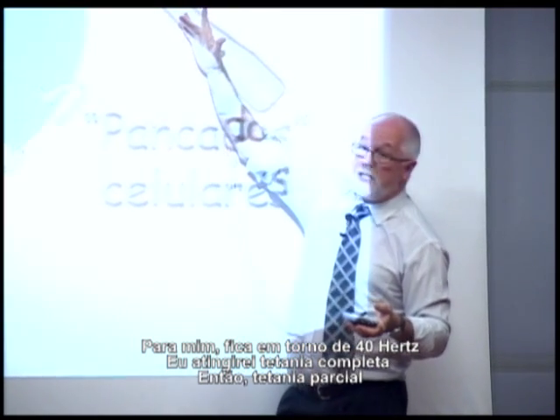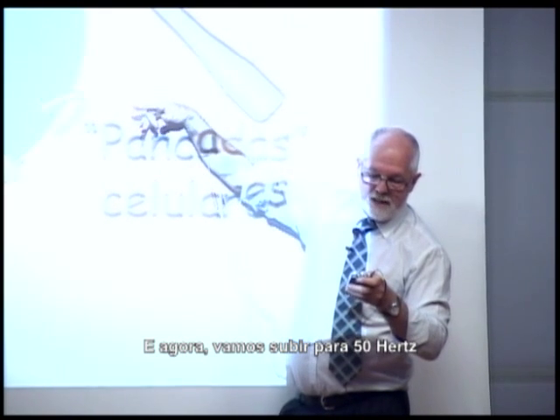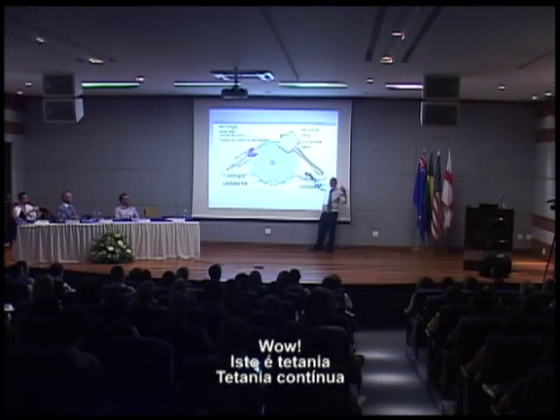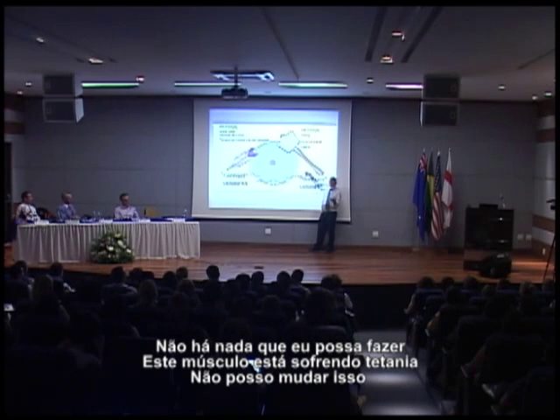So partial tetany, and now let's go 50 hertz. That's tetany, continuous tetany, all the time. That's not nice. All right? Okay. There's nothing I can do. That muscle is in tetany.